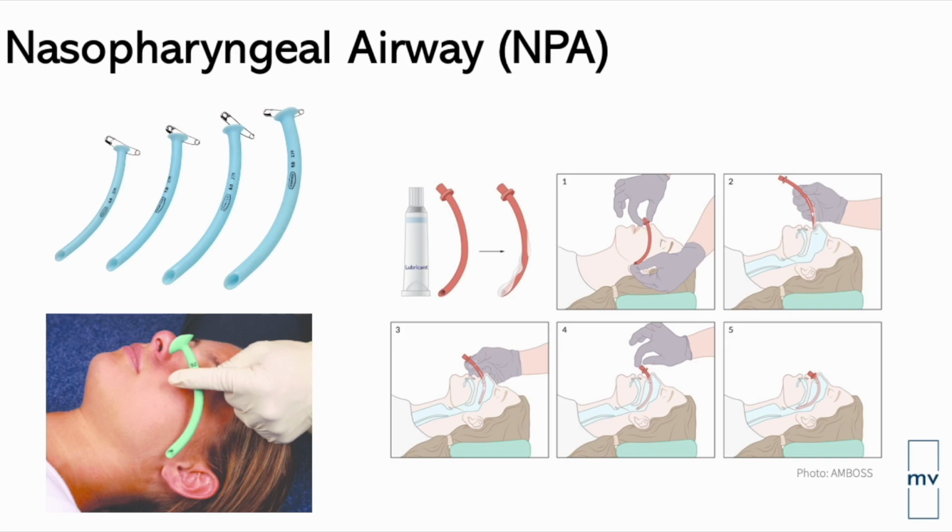That's because our nasopharyngeal airway doesn't really touch the pharyngeal muscles, it doesn't elicit the gag reflex, hence it's more comfortable for the patient because they're not choking. And so it's something that we tend to also use early on, and then if it doesn't suffice, we move down to other airway devices. The other thing that this one can be useful for, apart from patients who have a strong gag reflex, is for patients who can't open their mouth very wide, who maybe have a large tongue. So going through the nose is the benefit there.